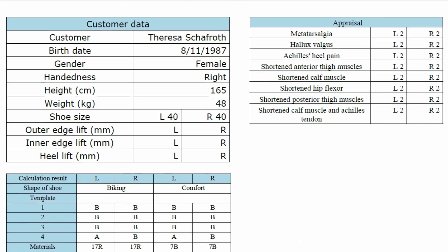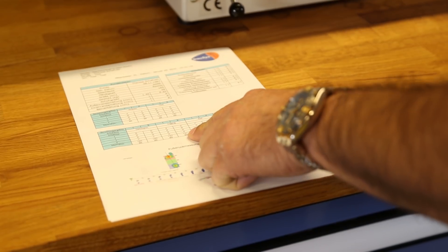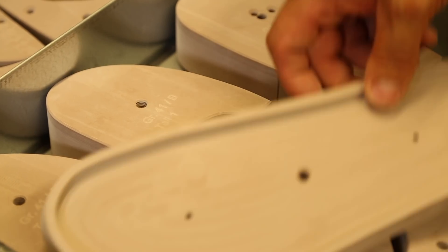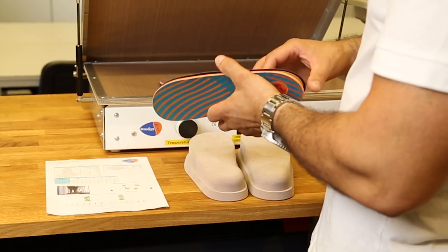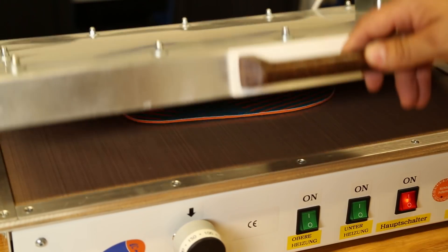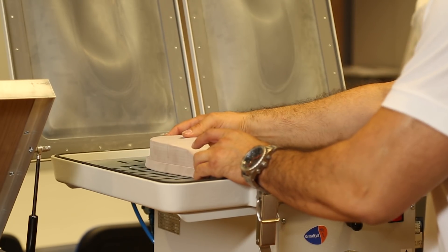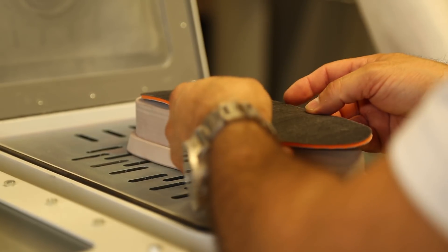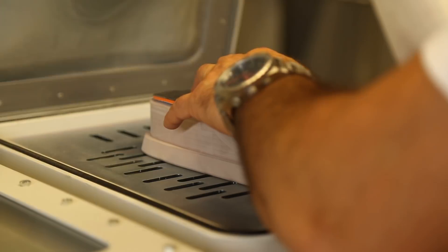After evaluating the data, the software provides all necessary information about the required modules and components of the desired lasts. The preset inlay components are first heated on a heating panel. Afterwards, the process of thermal forming takes place by means of the provided vacuum forming tools.